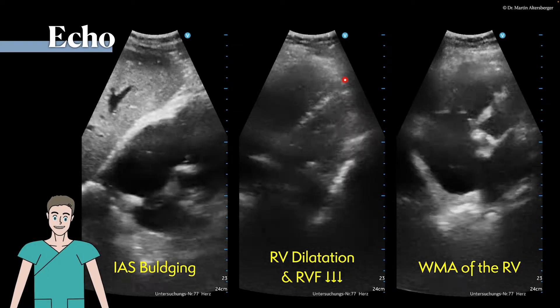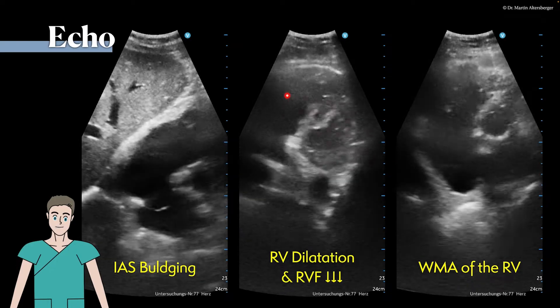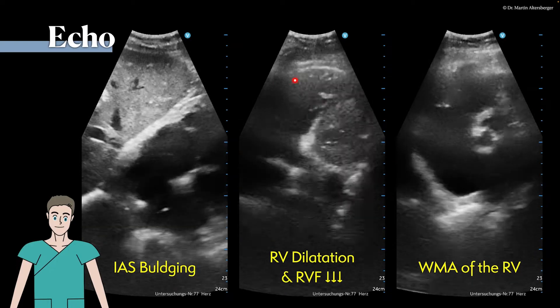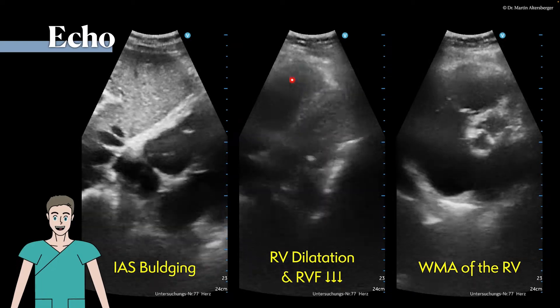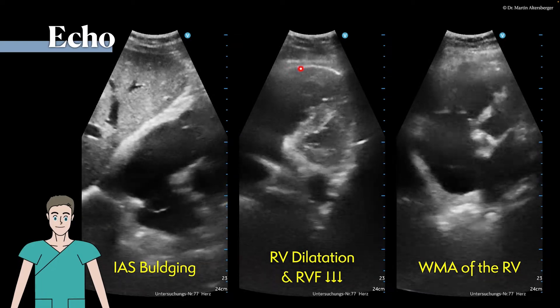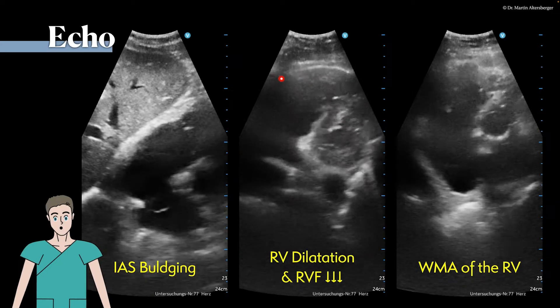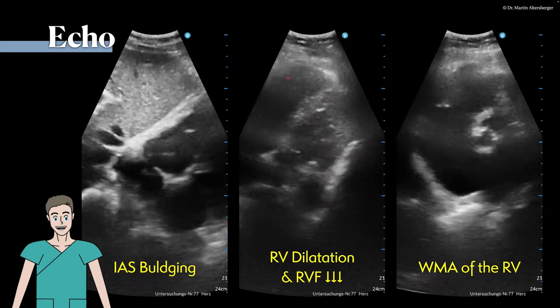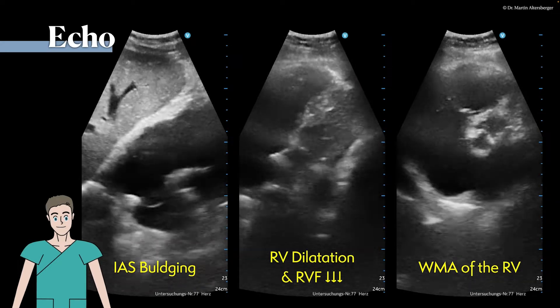We can see that the apical parts are still contracting, whereas the mid-wall, as we can appreciate here, is definitely akinetic.